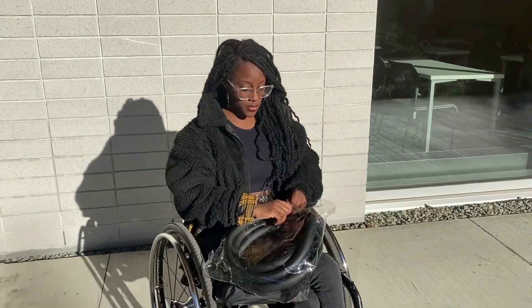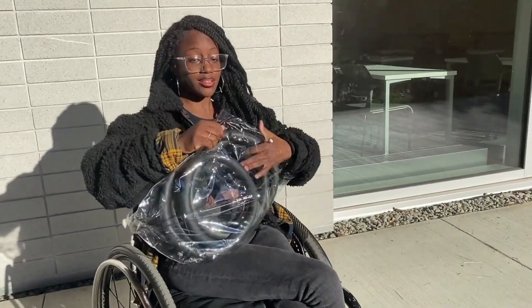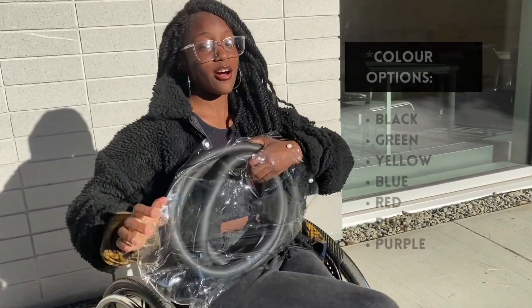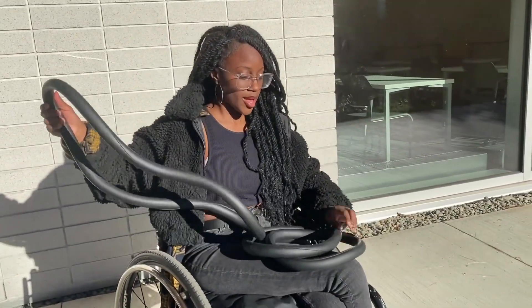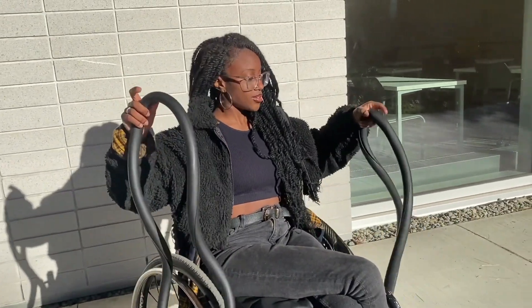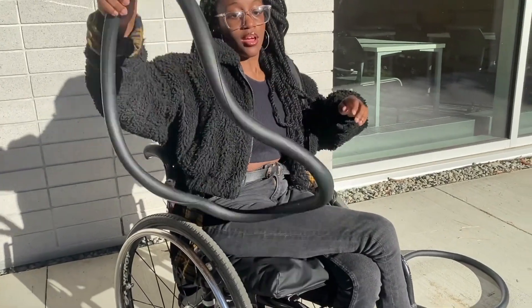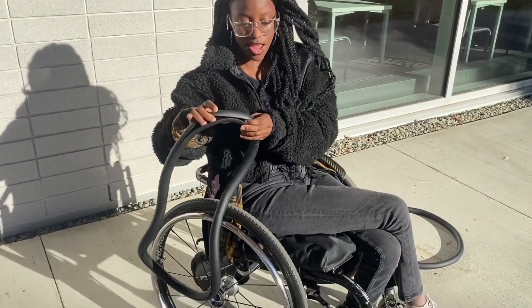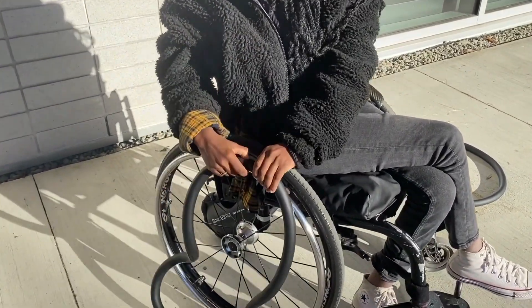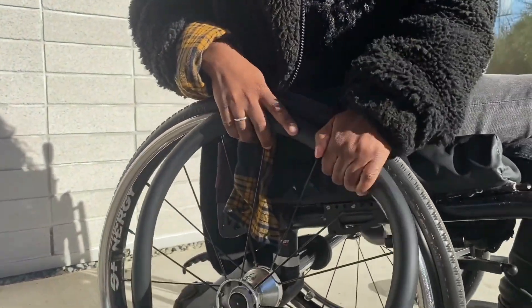So the first thing we're going to do is take them out of the package. I chose to get the color black, but they have other varieties of colors you can possibly get. I'm just a classic person and I like black, but they do have other cool colors available as well. They're pretty easy to put on while you're even in your chair — you just find one point where you want to start them, and I feel like it's easier to start at the top.